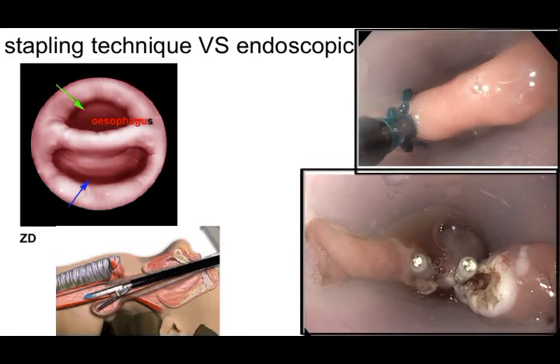Division of the septum with a flexible endoscope using cutting devices is a new and emerging approach, with some advantage over the surgical technique, particularly in the elderly and those with comorbidities, as there is less need for general anesthesia or neck extension. This was first described by Professor Chris Mulder from Amsterdam, Netherlands, in 1995.